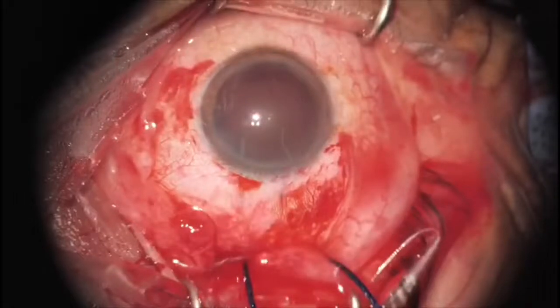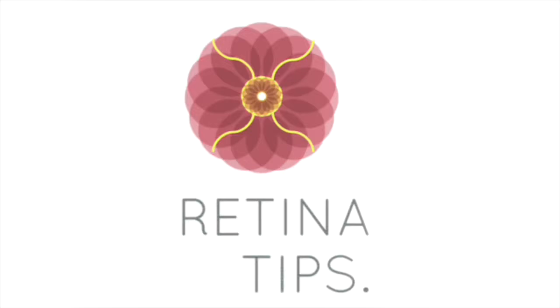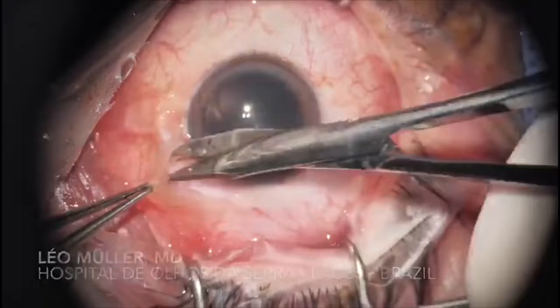This is a case of an intraocular foreign body shared by Dr. Leo Muller from Lages, Brazil. This is a 45-year-old male gardener with a history of right eye trauma while he was cutting grass with lawnmowers.